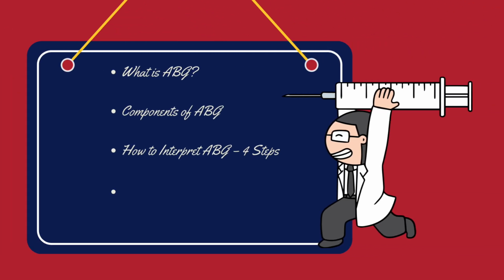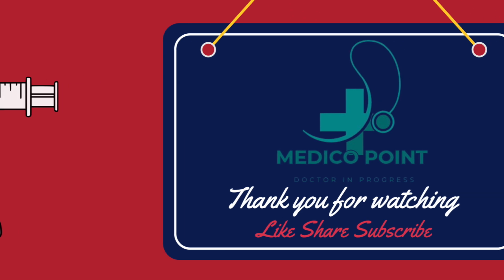Summary. To summarize, ABG helps evaluate a patient's acid-base status, oxygenation, and ventilation. By learning to interpret ABG results step by step, you can make quick and accurate clinical decisions.